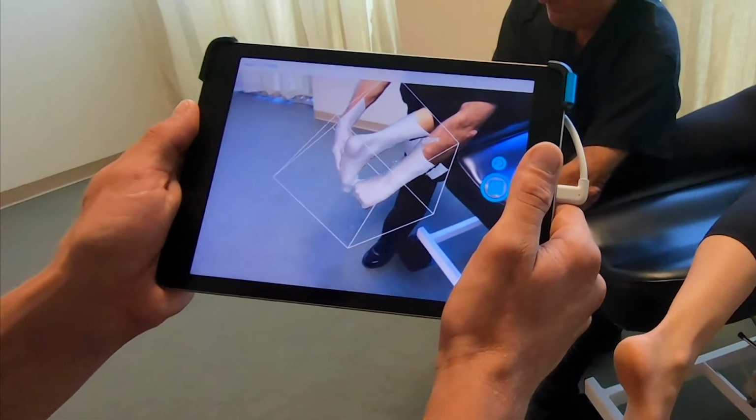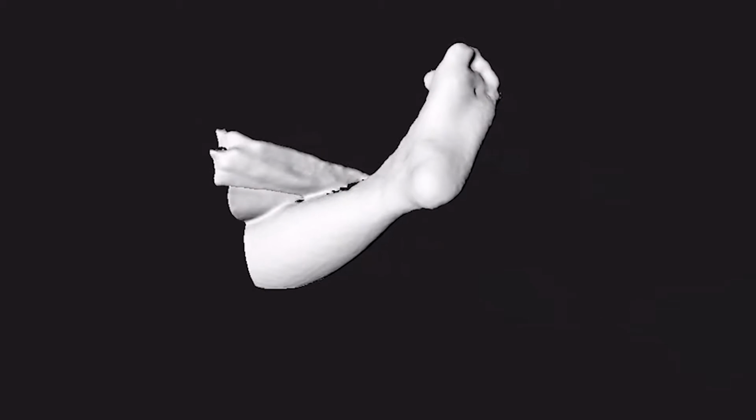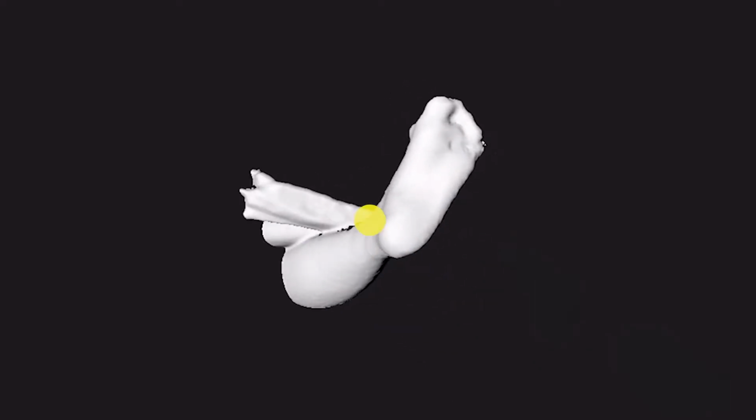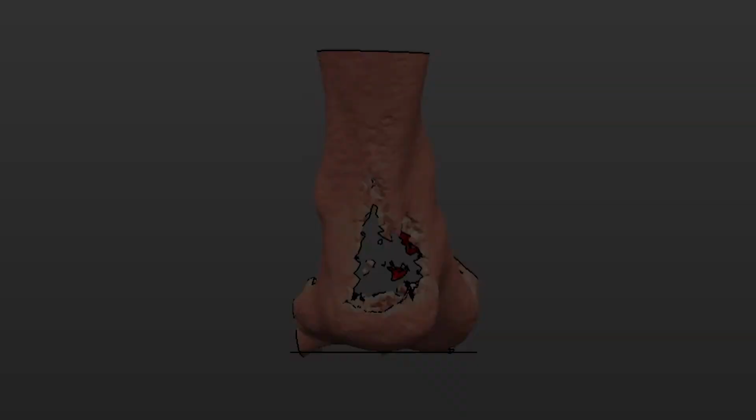When the scan is complete, review for accuracy. Make sure you've captured all the critical data that is required to manufacture the brace you intend to prescribe. This includes the entire plantar surface of the foot, the medial and lateral arches, the posterior aspect of the calcaneus, the medial and lateral malleoli, and the posterior aspect of the lower leg.